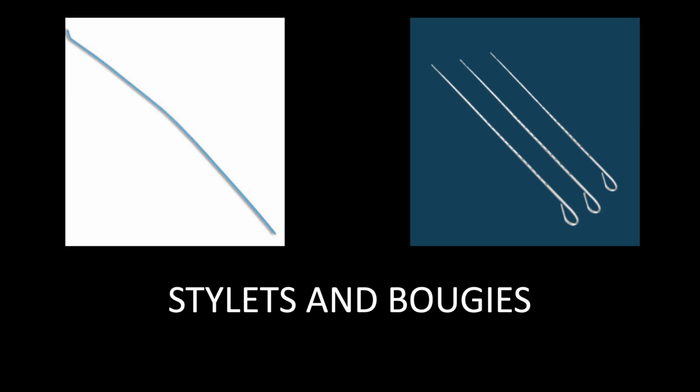The downside of stylets is that they're big, they're opaque, and in patients who have a tight or small airway, you do end up basically blocking the view of the laryngeal inlet, which you're trying to intubate. So it does make it more difficult.